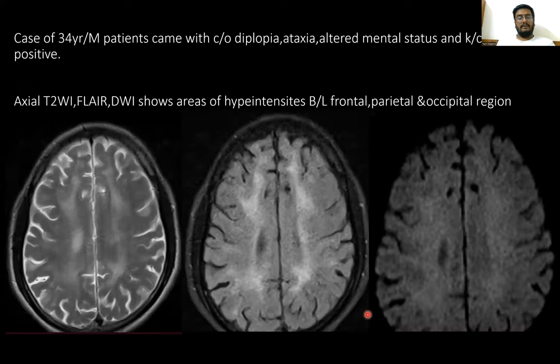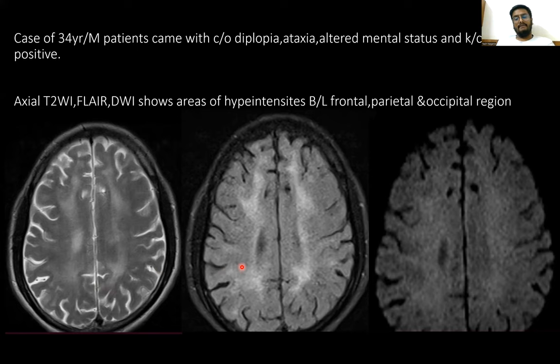Here is a case of a 34-year-old male presenting with diplopia, ataxia, altered mental status, and known HIV positive. On axial T2-weighted image, there is a hyper-intense lesion in the subcortical fibers crossing the splenium, showing the barbell sign. On FLAIR imaging, it shows hyper-intense lesion in the same areas. On DWI, there is somewhat diffuse restriction in the same areas, though not a complete diffusion restriction.